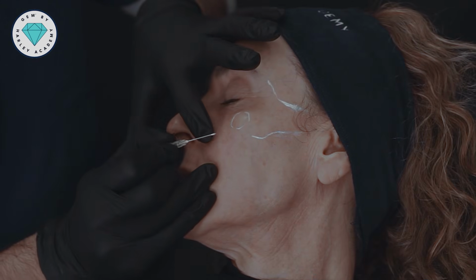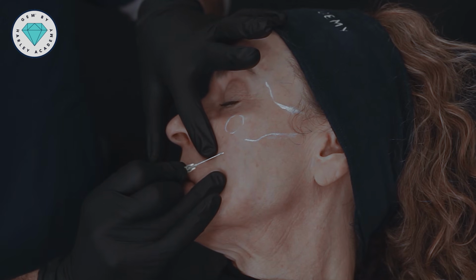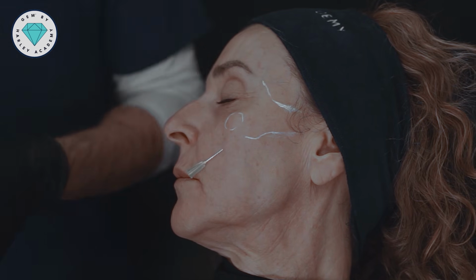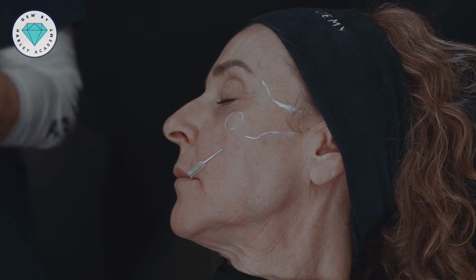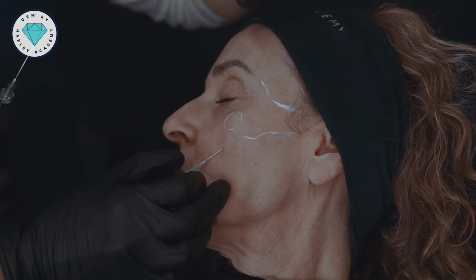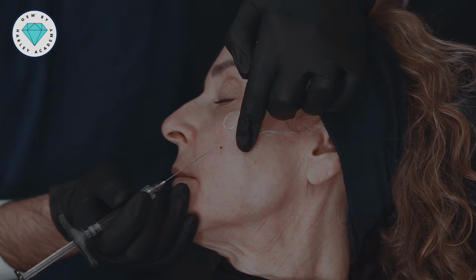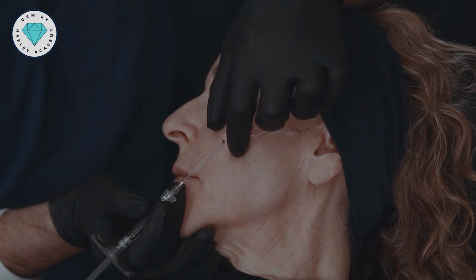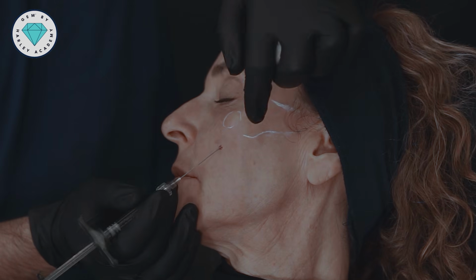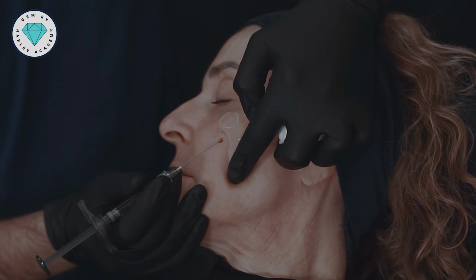Okay, so let's make our entry point for the lateral zygoma first. Little scratch. So I'm using a 22 gauge cannula, and I'm just going through the dermis with the needle. And then let's talk about the layers that we need to move through. So if we go into the subcutaneous plane, we need to move underneath the orbicularis oculi muscle. So this is that tethering and dimpling there. So there's a little pop.